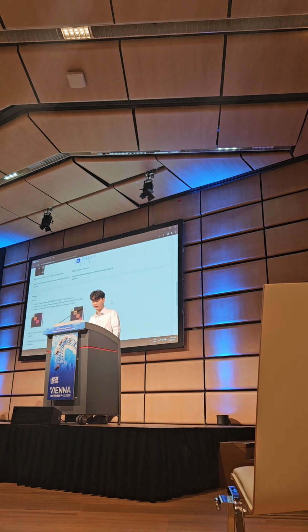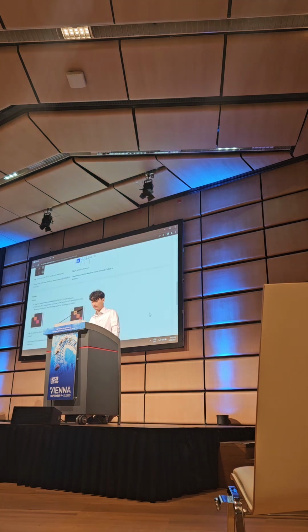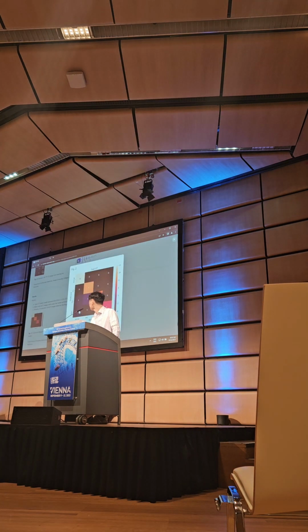Results. Surprisingly, our simple architecture achieved 90% accuracy in the dual-phase-based model. However, when only delayed-phase images were used, the accuracy dropped to only 0.77. Notably, if you look at the confusion matrix for each classifier, whereas the delayed-phase-based model fails to differentiate any MSA cases from other cases, this is the actual and Y is predicted, our dual-phase-based classifier was able to achieve the task at the cost of incorrectly classifying some normal cases.